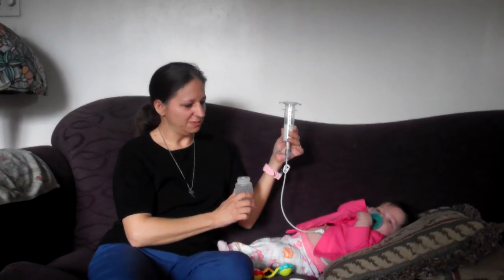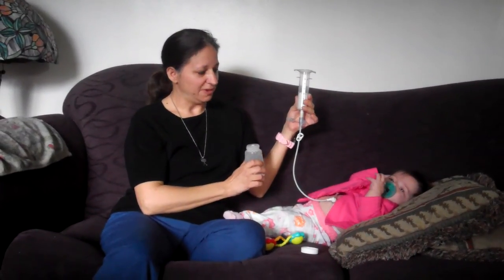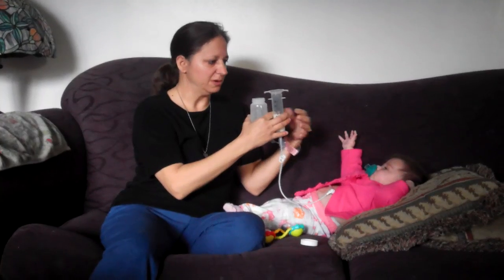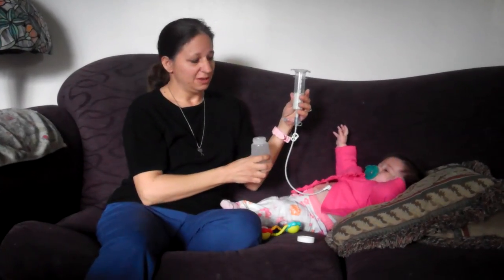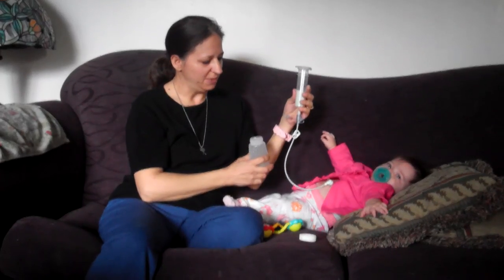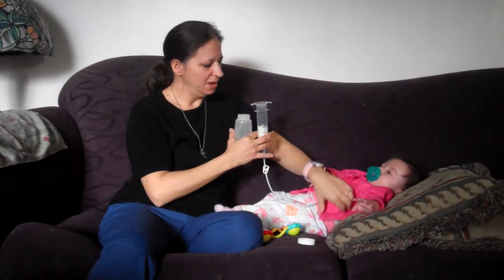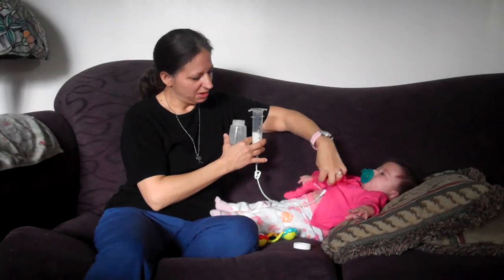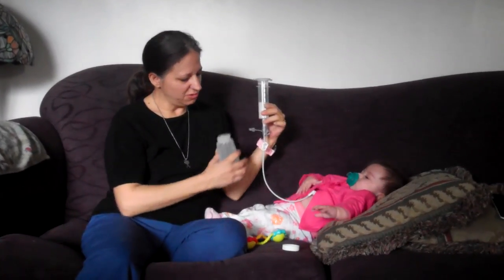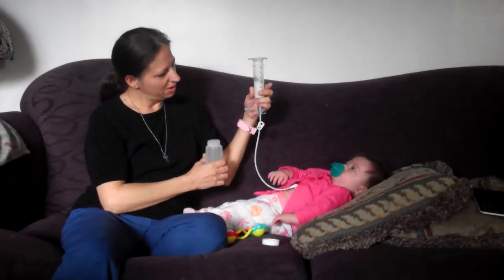None of this is that difficult, and the more you do it, you'll be very comfortable. If I had to, I can always pick her up while I'm feeding her and do something that can't wait. I can scoot her up while I'm feeding her, but it's good to just have a relaxed atmosphere and have everything you need. Keep an eye on her hands, and that she doesn't scoot down. Maybe have a blanket underneath her legs here.